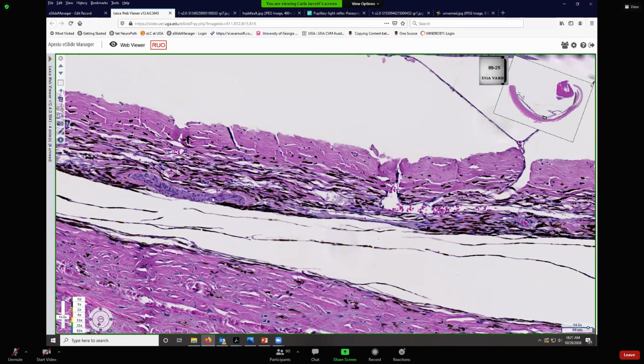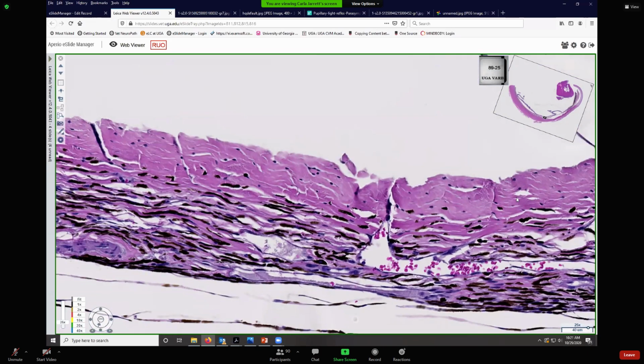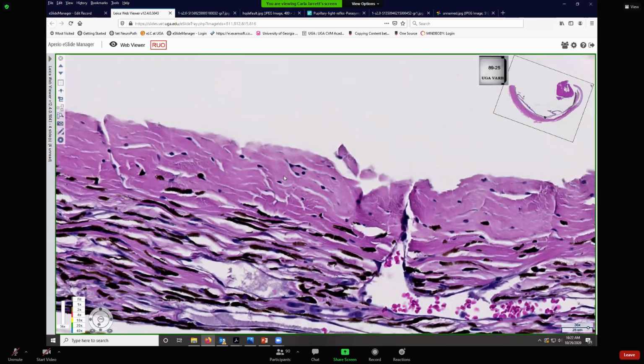Here we have a nice large muscular artery. Here we have a large vein. And then what is this? That's weird. It looks like dense irregular connective tissue, but it's wider, thicker, flatter. This is a fibrous tapetum. So here are the collagen layers of the vascular layer.